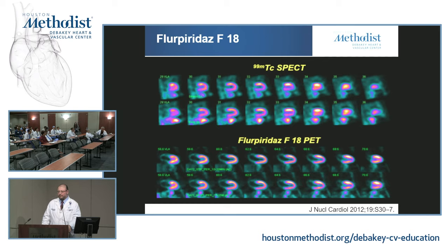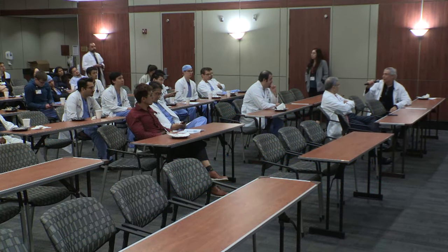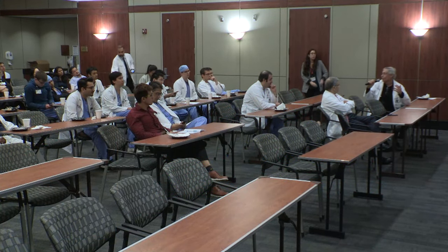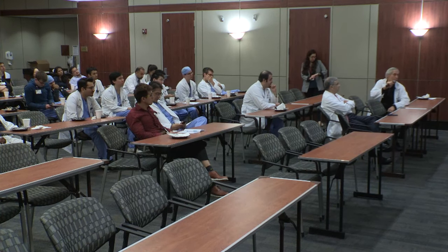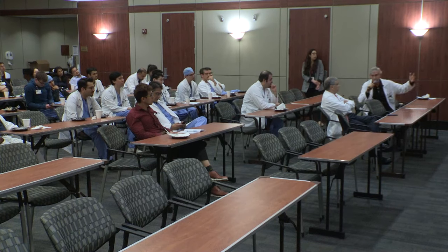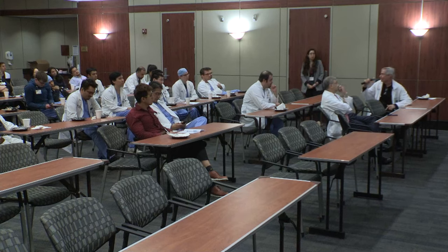Just one other thing: we would prefer that the reason the patient is enrolled is not because of a positive SPECT study, because that would cause a tremendous amount of intrinsic bias. So we would prefer to have people because of abnormal calcium scores or abnormal CTs or whatever that you want to take them to the cath lab for, not because of an abnormal perfusion scan.